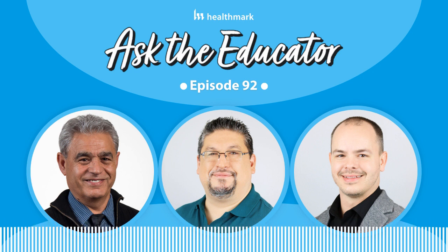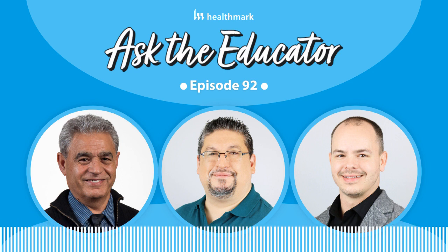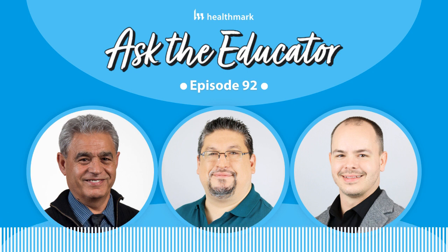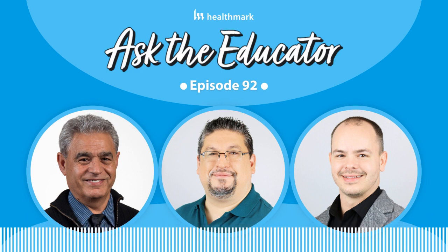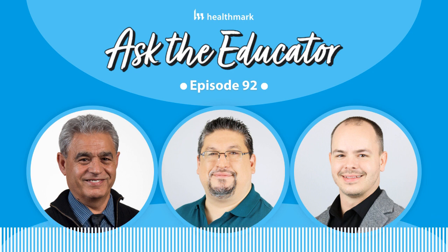Now you have a lot more energy coming through, but not enough strands of wire to carry that energy to the instrument. Therefore, you get a big zap coming out, smoke, and catching fire, most of the time at the instrument side, the equipment side. That usually causes the surgical fire or burn, obviously, if it's near the patient.